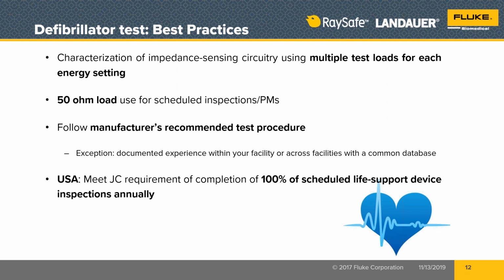Oh, the third situation for the testing would be if the doctor or the nurse doesn't feel that the output energy dialed into the defibrillator was fully delivered, they may have a complaint. You're going to go to the clinical unit. You're probably going to have to bring that defibrillator down to the shop to do the testing. And you're going to need to be able to repeat these tests and show, no matter what the load was, that the output energy was delivered.